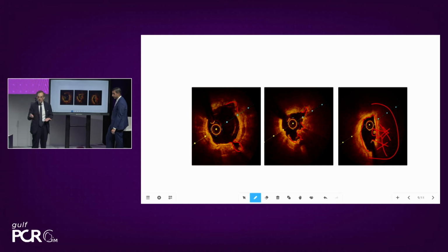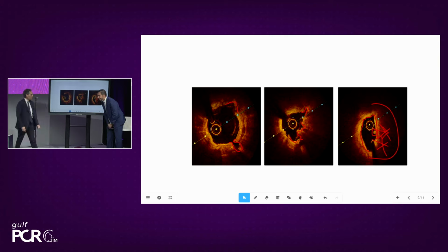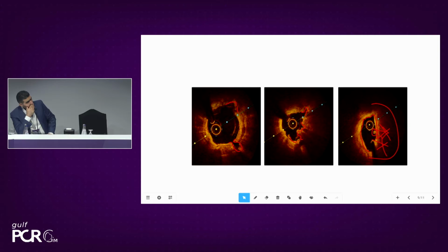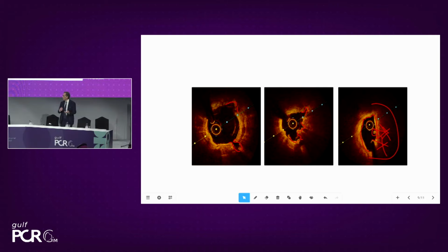Before getting to the stent, you need to realize if your lesion preparation was effective or not, and in which segment it was effective or not. And I think, Dr. Giulio, this is predicting what results we're going to see with the stent. Correct. You already know, without looking at the post-stent angio. That is a very important point. So spend your time on lesion preparation to understand before, going segment by segment, try to get the right measurements, and try to check, because the cost of the catheter is the same if you're using it before, during, or after. So it's much more important to get all the information across.